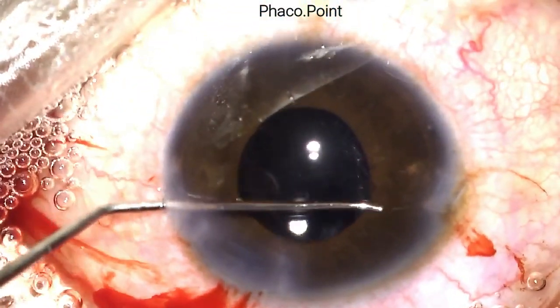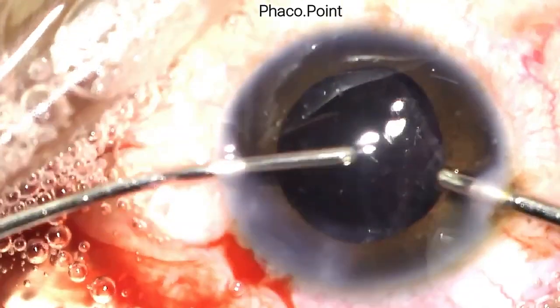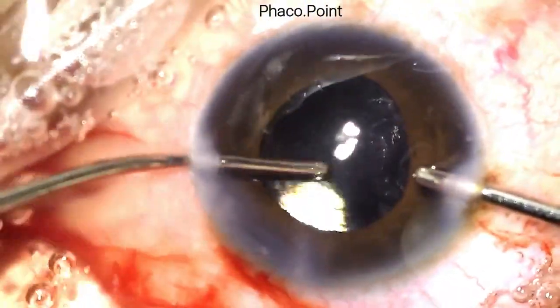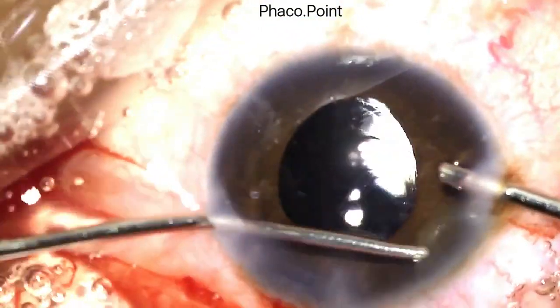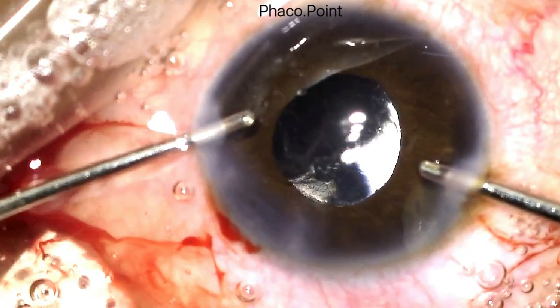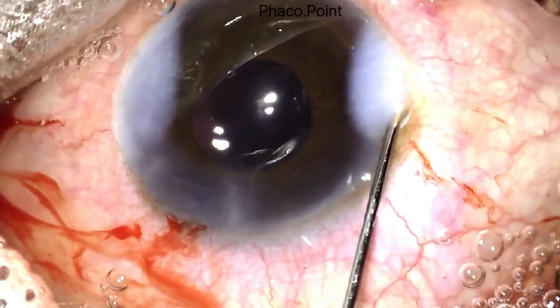I use a Y-shaped hook to retract the iris and confirm the position of the three-piece IOL. I then proceed to removing the excess viscoelastic from the anterior chamber. It is important to avoid any rocking movements of the IOL, as even at this stage it is possible to compromise the anterior capsule. A very gentle removal of all viscoelastic is therefore performed, followed by stromal hydration to complete the surgery.